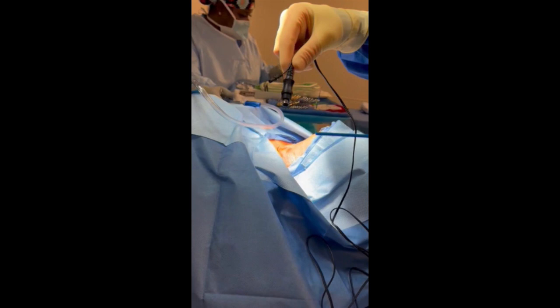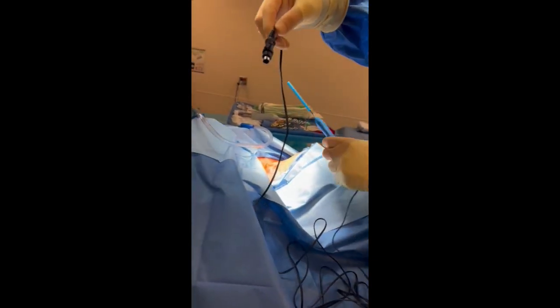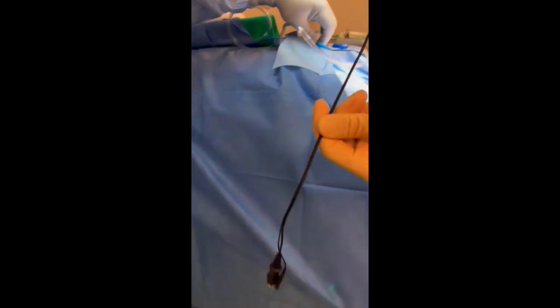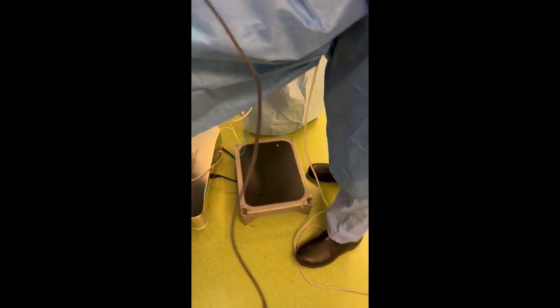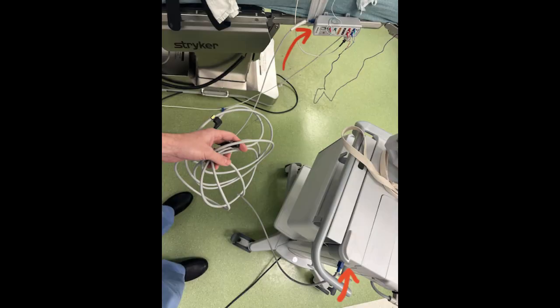The stimulator has a plug-in that looks like this. You pass it off to the circulating nurse who goes under the drapes. In this case it has a hard time finding a way to plug it in because this particular plug-in needs an adapter. The adapter is located on the module cord — it's just clipped or wired onto that cord — so you spring that over and plug it in.